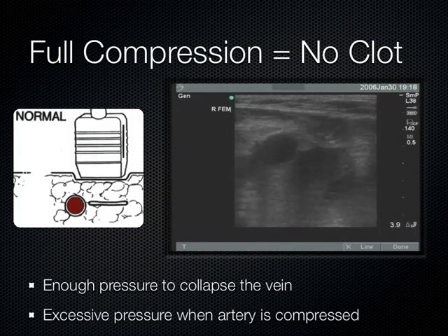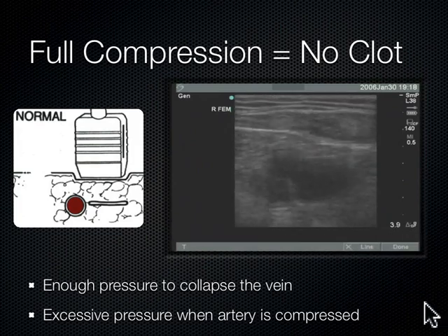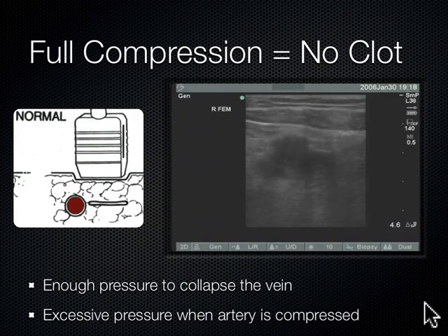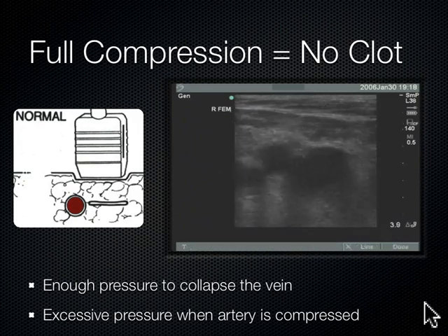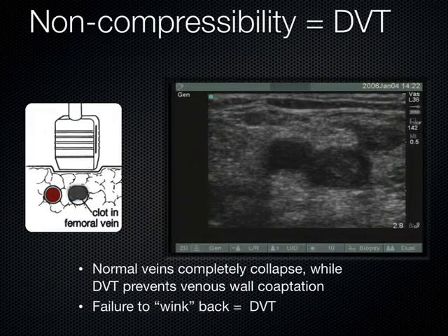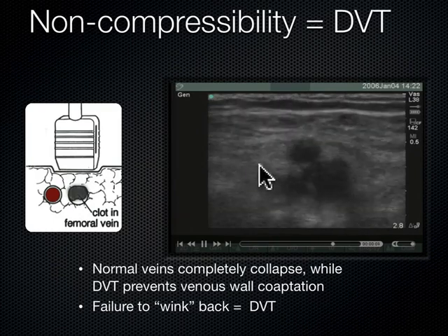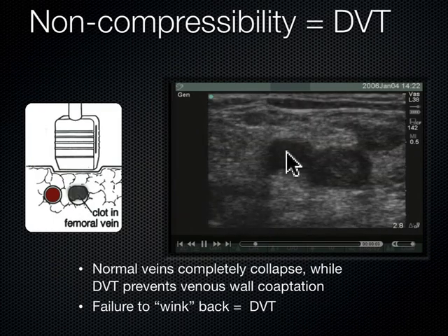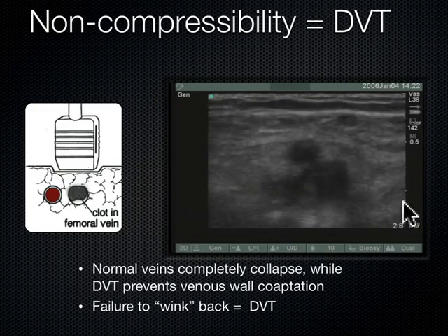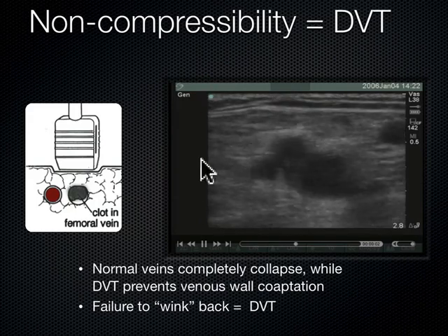With video we can see the common femoral vein easily compressible, the arterial system stays open. It's just enough pressure to compress the vein — you know you're pushing too hard if the arteries start to compress a little bit. This is what it looks like when you've got a clot. Which leg? Right leg — because the vein is medial.